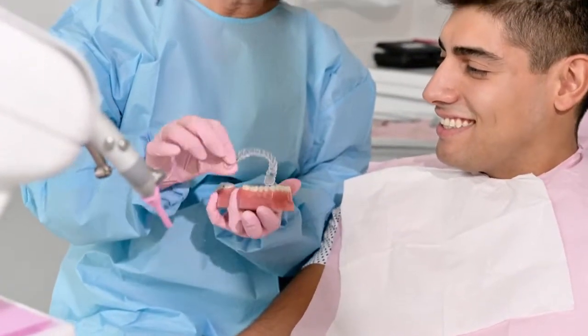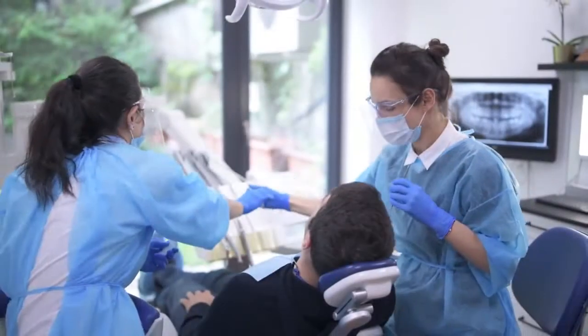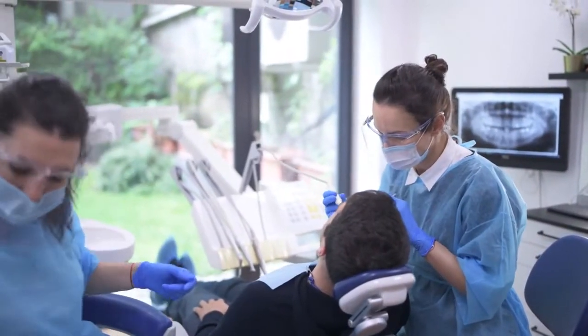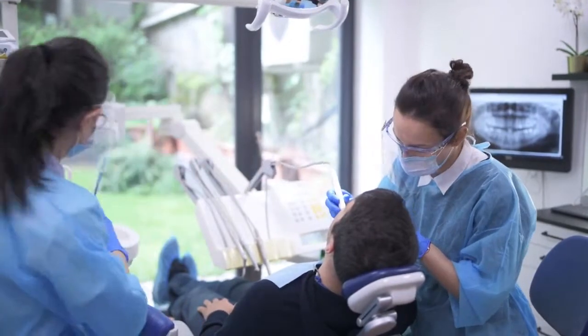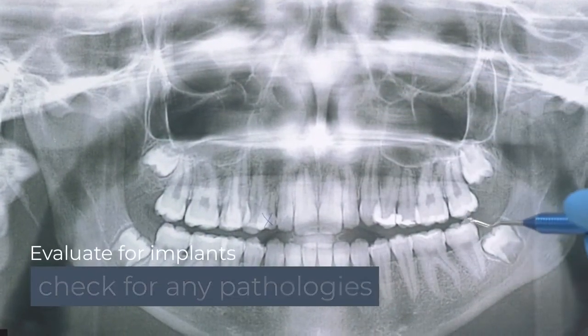Panoramic x-rays are usually taken prior to orthodontics if you're getting braces, or for extractions if you need to get a tooth pulled, and for other various reasons, such as to evaluate for implants or check for any pathologies in your mouth.